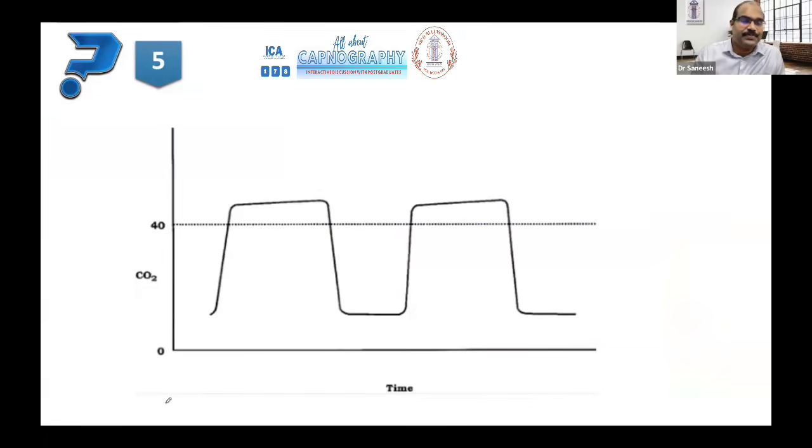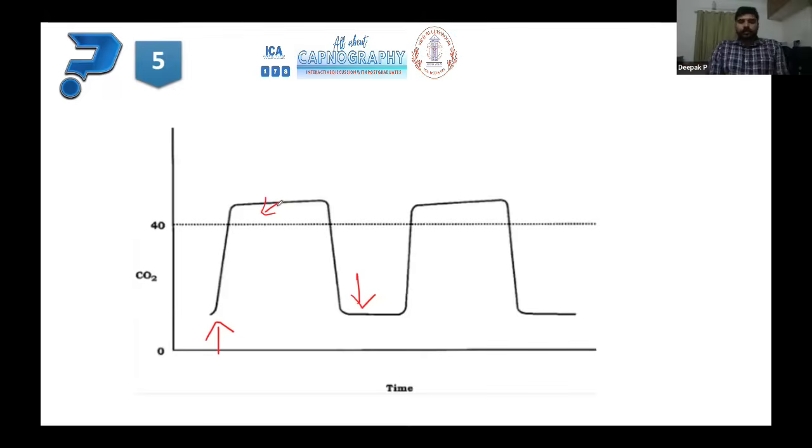Yes, Dr. Deepak, please. So this is a rise in baseline, probably due to rebreathing of carbon dioxide. Okay, this is very important. So far, we have seen traces where the baseline is 0. Here, during inspiration, it's not coming down to 0. Then why didn't you comment on this value? Because this is overshooting our high alert mark. So that is due to the increased baseline. Yes, because the baseline itself is shifted up, your EtCO2 also will be correspondingly showing higher values.